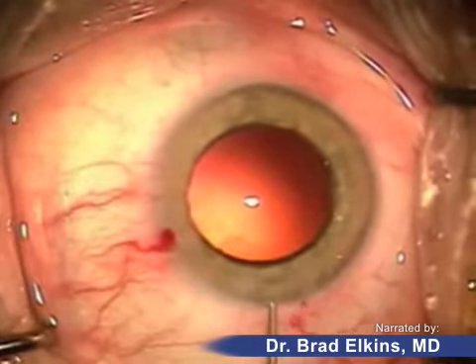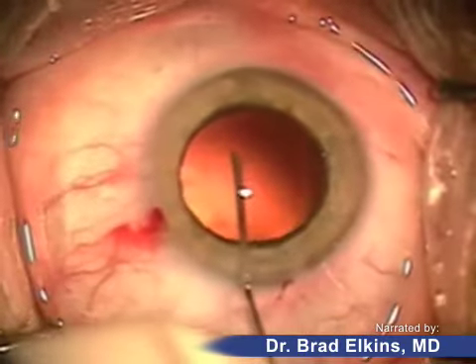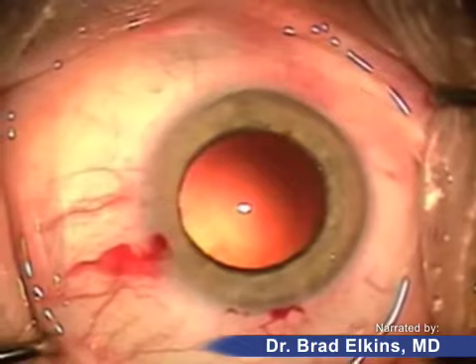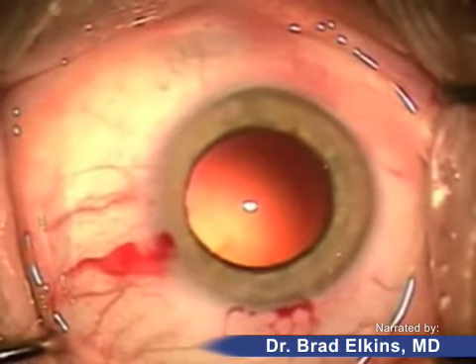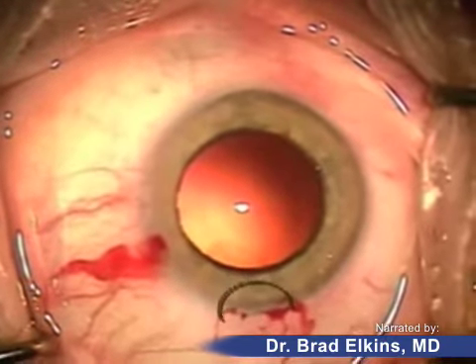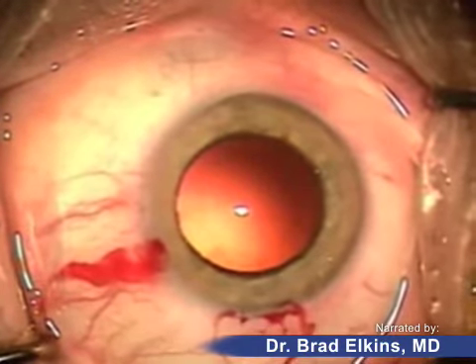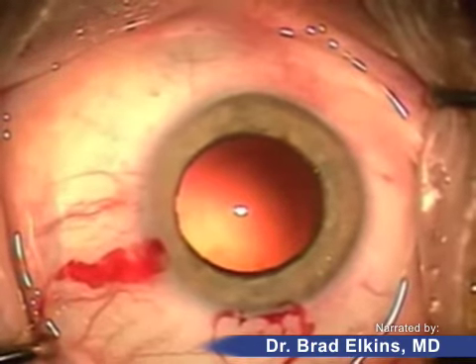The front part of the eye and the bag are going to be filled with viscoelastic again to maintain shape and structure. This intraocular lens is called a crystal lens, and its major advantage is that it can give patients near vision — it accommodates by moving slightly forward and backwards to achieve good distance and reading vision. It goes through a small three-millimeter incision and unfolds inside the eye. Foldable lenses minimize astigmatism creation, wound leaks postoperatively, and infection risk.